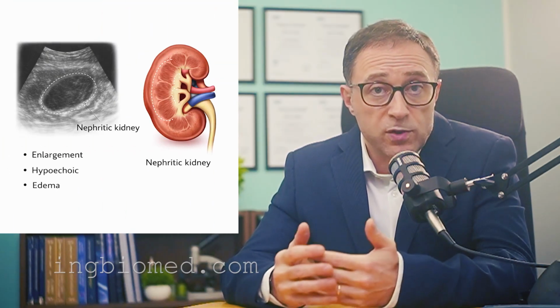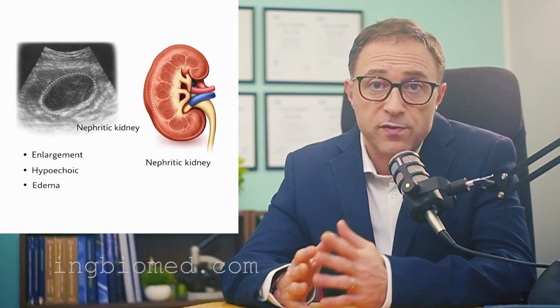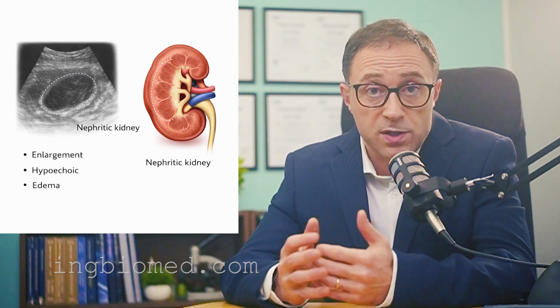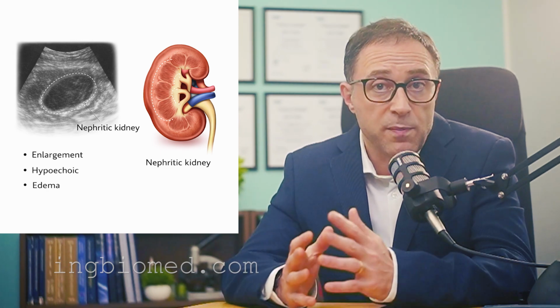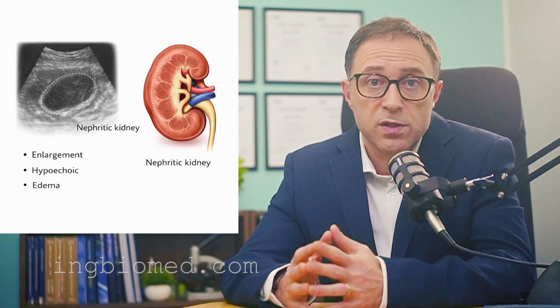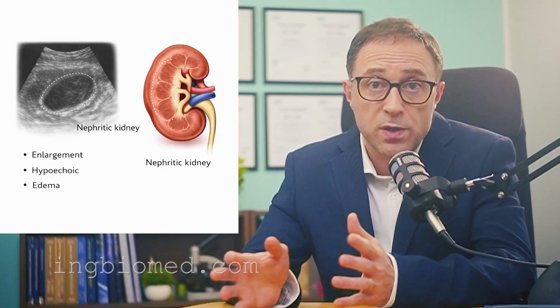In inflammatory processes such as nephritis, ultrasound findings can be subtle. The kidney may appear enlarged and hypoechoic in acute stages due to edema, with blurred cortical-medullary differentiation.